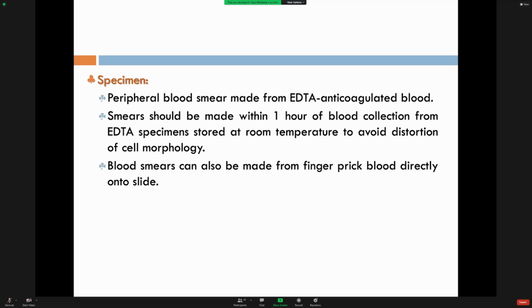It could also be taken during bone marrow aspiration as a sample, because during bone marrow aspiration there is the aspirate, which is the liquid part, and the biopsy, which is the bony pieces. So you can obtain the specimen through these 3 ways.